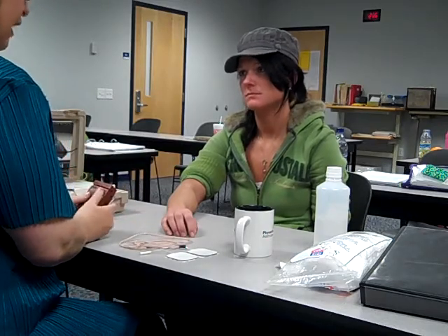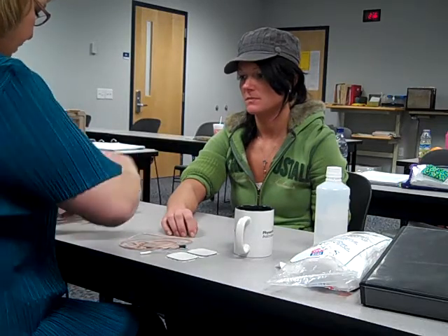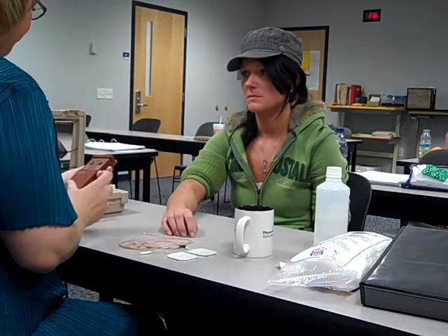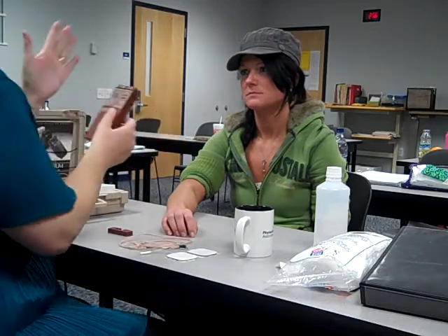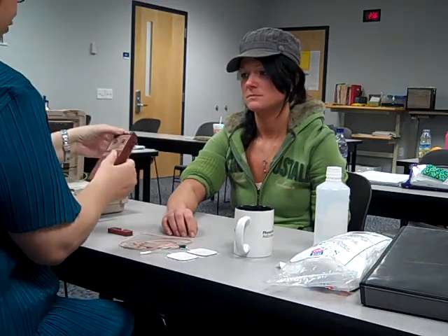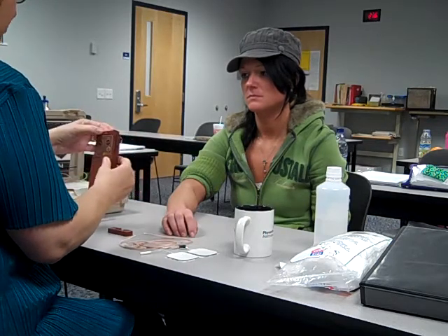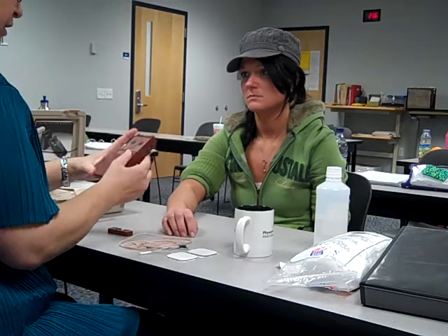Because you told me your pain is an eight, we're going to use what's called high rate TENS. I'm going to set the settings here — the rate is going to be at 100, and the width is going to start at 50. I'm going to turn it on for just a second to check — it's on multi, so I'm going to change it to normal, then turn it back off. So those are set the way I want them to begin with.